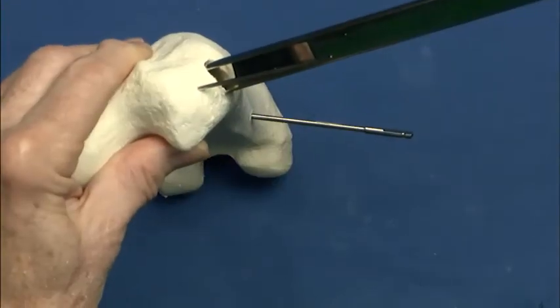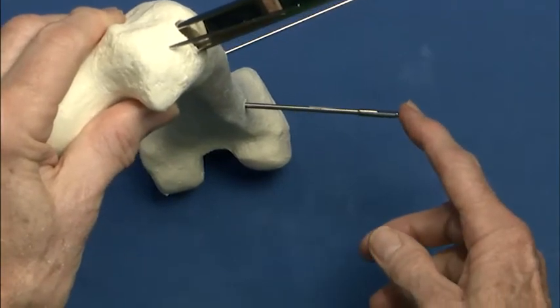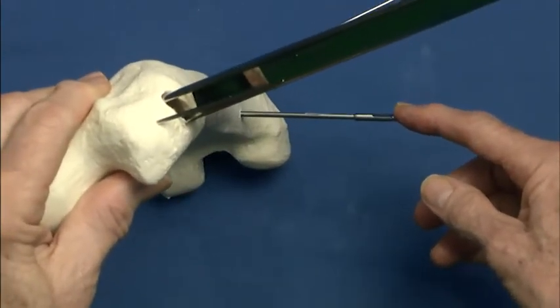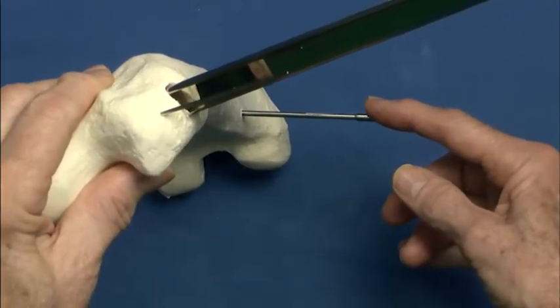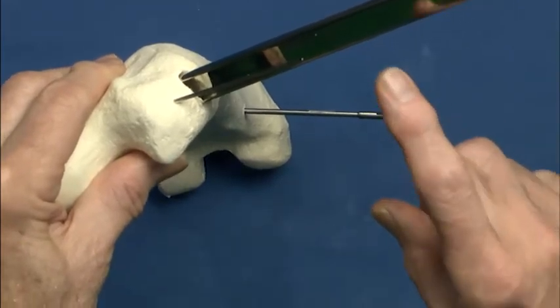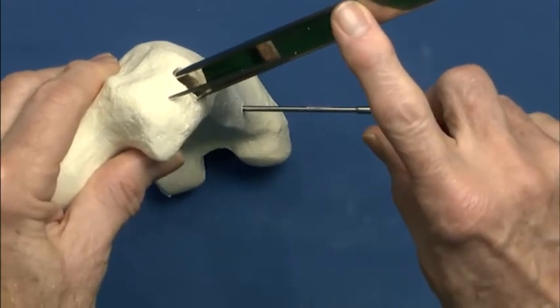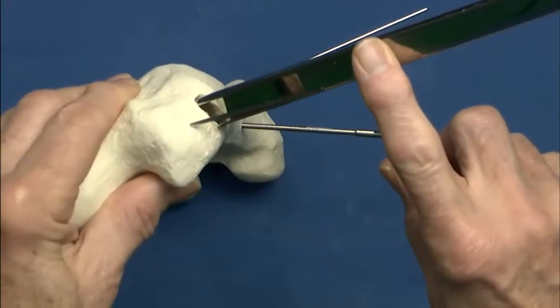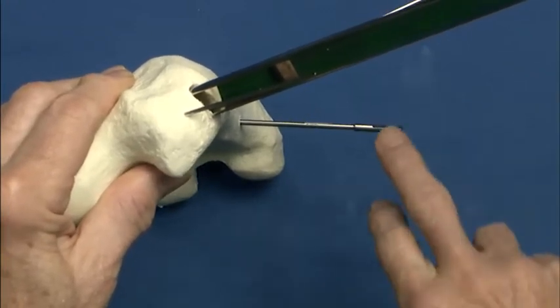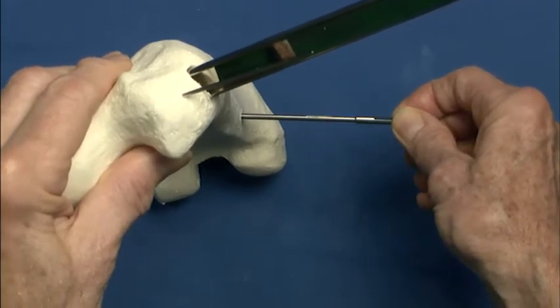Now at this point, the seating chisel is fully inserted. And what I've done is place a 3.2 millimeter drill bit distally, which subtends a 20-degree rotational correction for the anteversion. So I'm using the seating chisel, or ultimately the blade plate handle itself, as one portion of the correction determination, and this relatively stiff drill bit distally as the other portion.